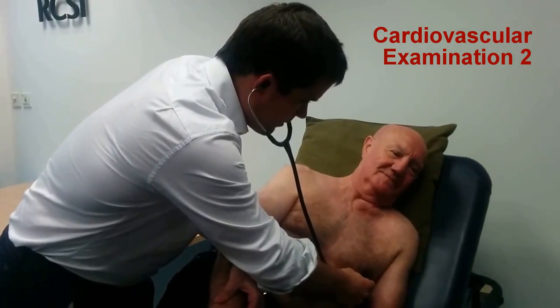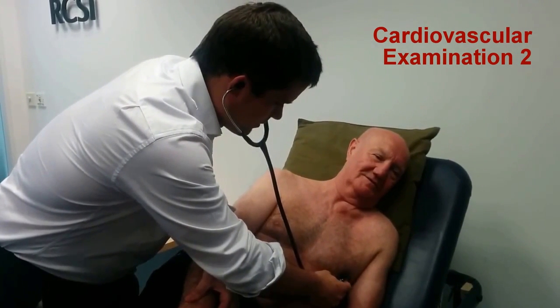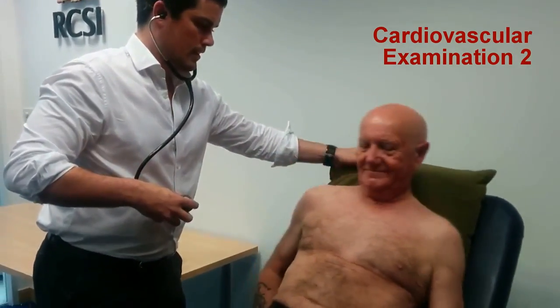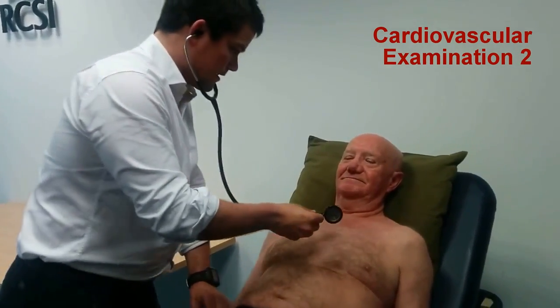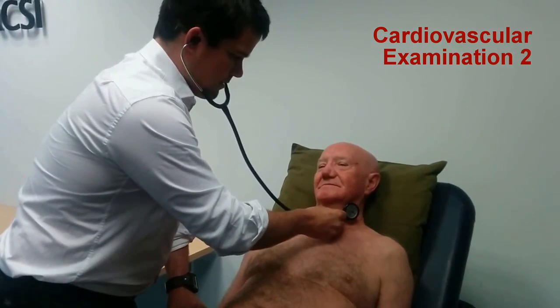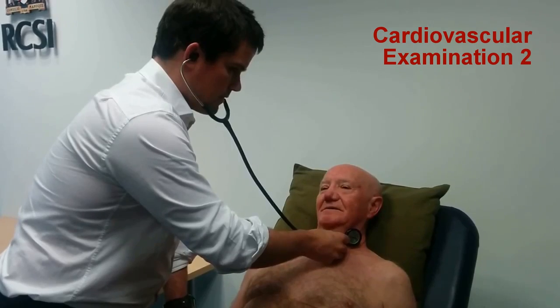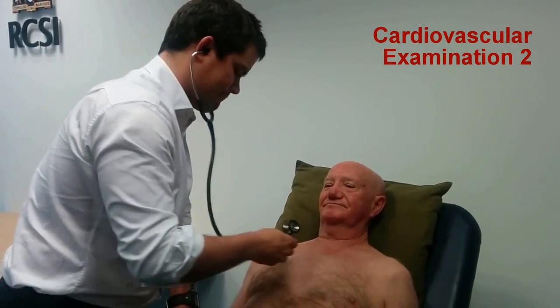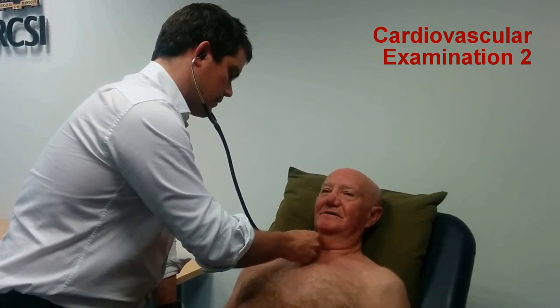Big breath in and a big breath out. And hold your breath. Thanks, you can breathe normally. I'll just get you to go back lying in the bed, thanks very much. It's good to put this on your neck, is that okay? Big breath in and out. And hold. Big breath in and out. And hold.